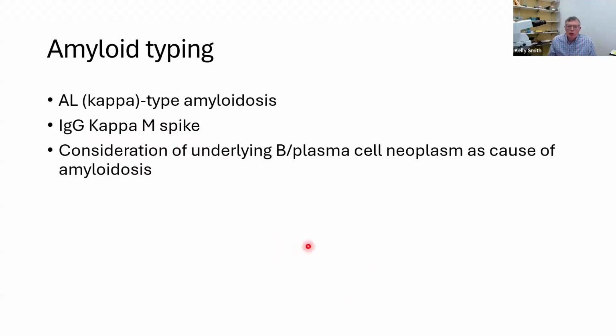And the thing that we always have to remember is that with a monoclonal immunoglobulin, especially one that's incorporated into this amyloid fibril, there can be a number of reasons that we don't see staining that really correlates with what we're seeing by mass spectrometry. One would be that maybe the masking of the epitopes due to the incorporation of the light chain into the fibrils is a cause.